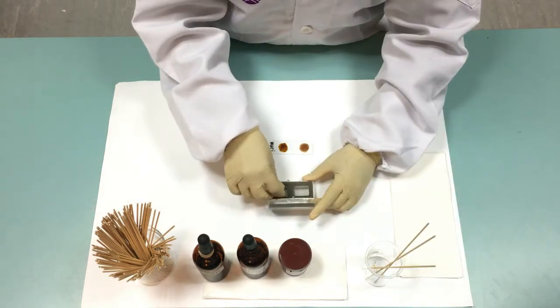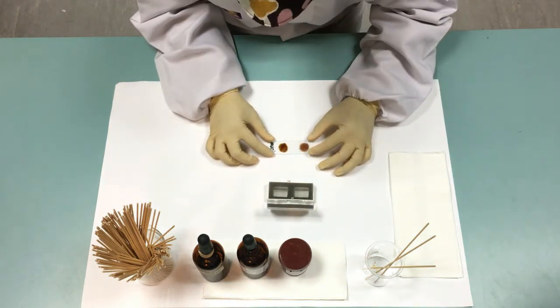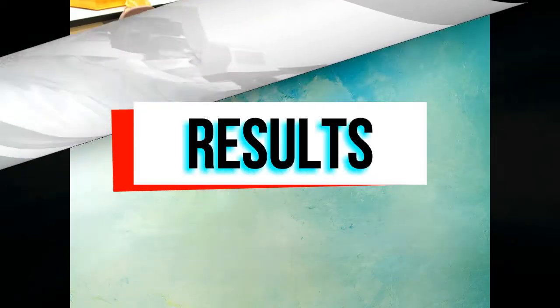Lastly, put on the cover slip slightly onto the suspension. Now, examine the slide by using microscope.